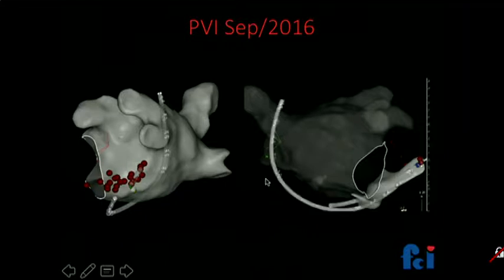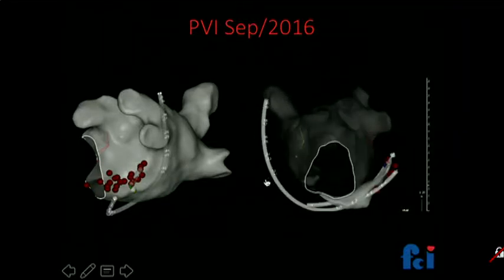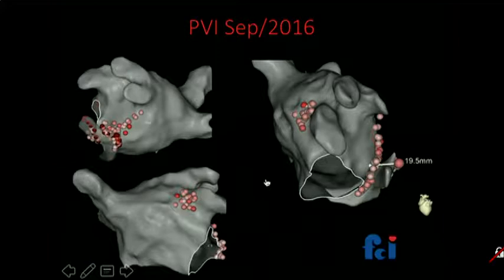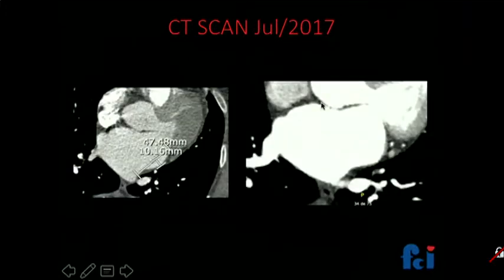Therefore, we diagnose perimetral flutter. Endo and epicardial ablation of the mitral isthmus is done, and at the end of the procedure, we find a bidirectional block of the isthmus. This is the final set of ablations, and after performing the lesions of the mitral isthmus, there is evidence of focal tachycardia in the anterior wall of the appendage, which is solved with ablation.